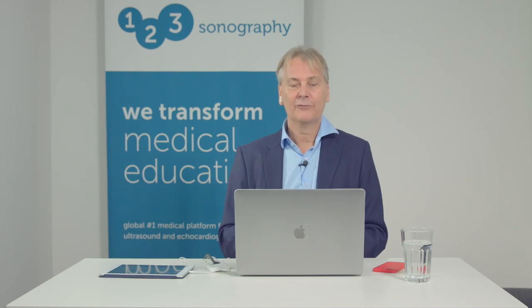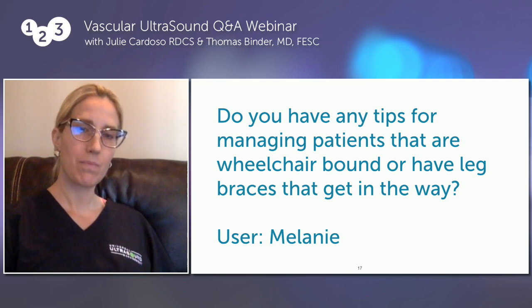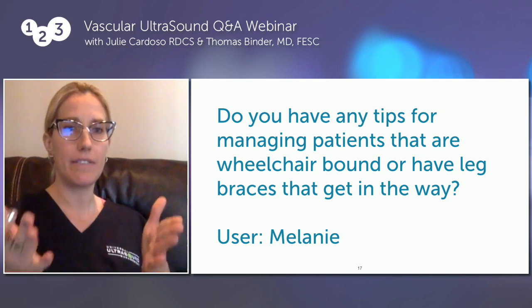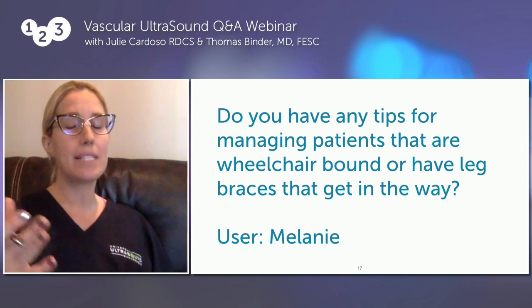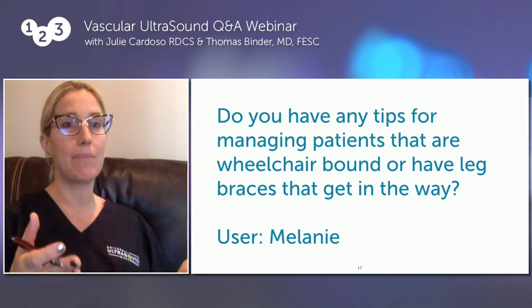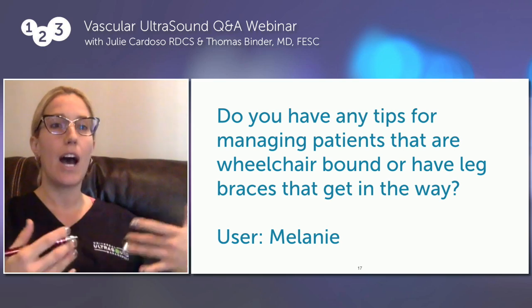This is a question from Melanie, and she wants to know, do you have any tips for managing patients that are wheelchair bound or have leg braces that get in the way? How do you manage these patients, Julie? Very creatively, but also we want to take into consideration ergonomics. Fortunately, some facilities may have lifts that they use to lift these patients out of the wheelchair onto the bed, in which you can assess the patient appropriately according to your protocol. But some facilities do not have access to lifts, so we have to be creative. We can assess these patients in a wheelchair, but we just got to be careful and thoughtful, by having the patient lean back so we can get into their groin region.